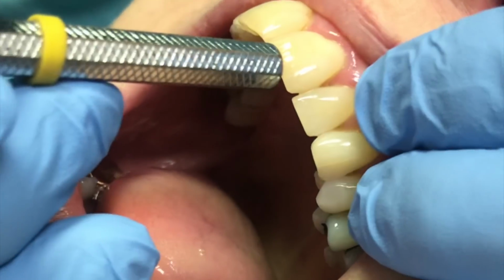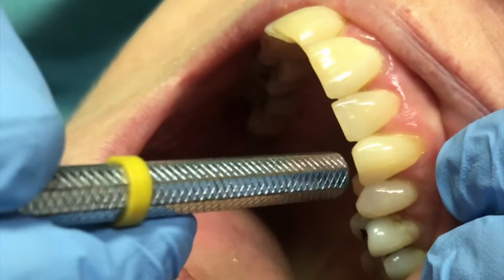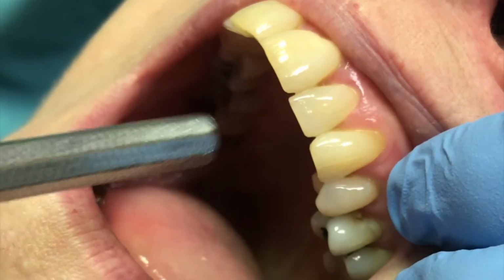So we're just doing a tap test. We've done our vitality test. So this test, the tooth number 24 tested cold. So you can hear the difference. We'll do it one more time.